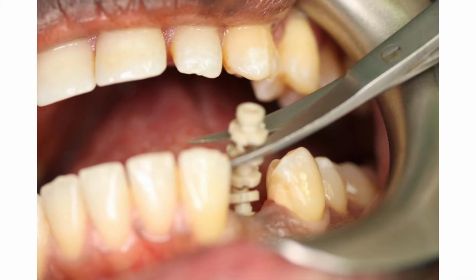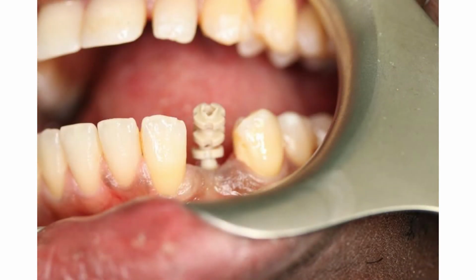Now the next point is we have to reduce the height of this component, and because it's hollow you can take some scissors and you can just snip it. The nurse can have the suction tip handy just above it, and as soon as you snip it, it gets sucked away into the suction tip. Here we are at about the right height, at the right angle, and we're now ready to take our impression.